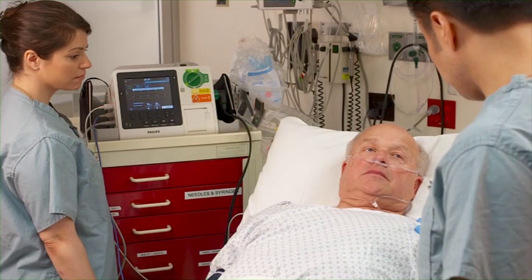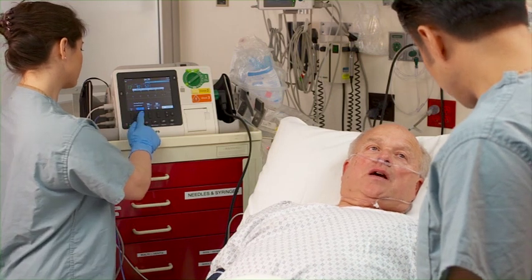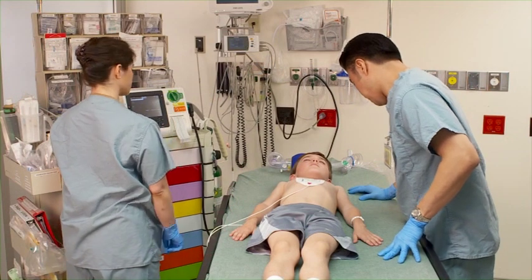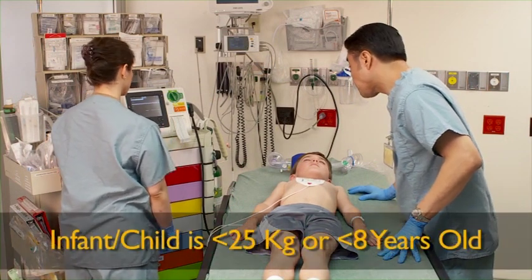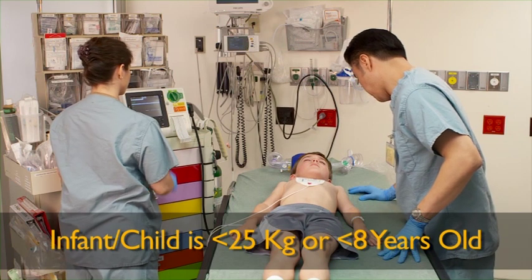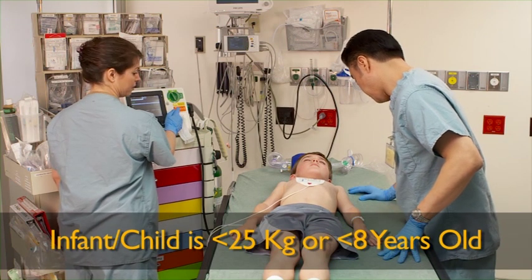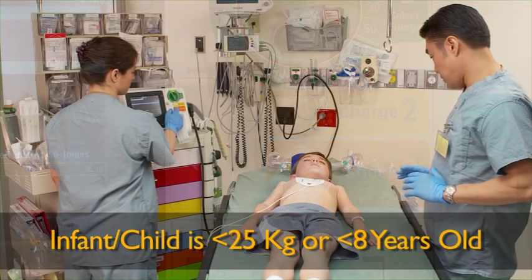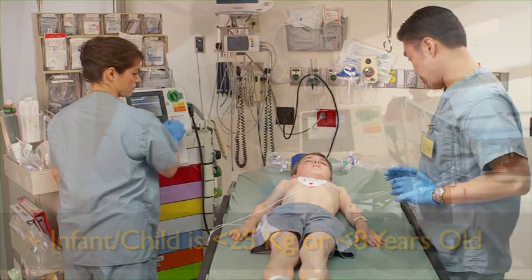The optional pacing mode offers non-invasive transcutaneous pacing therapy. In AED mode, the HeartStart XL Plus analyzes the patient's ECG — infant, child, or adult — determines whether a shock is advised, and guides you through the resuscitation process. Infant/child is defined as less than 25 kilograms or less than eight years old.